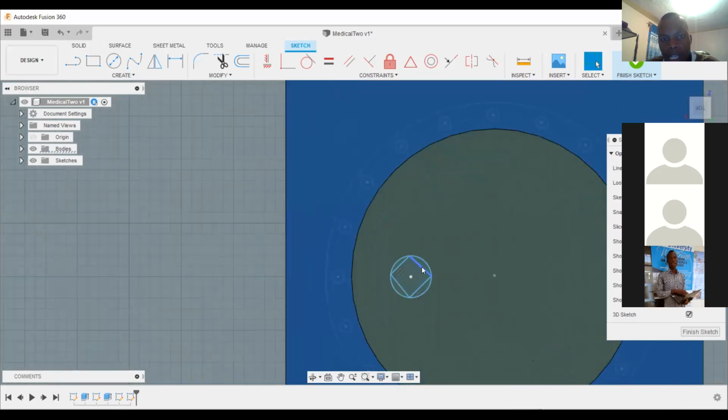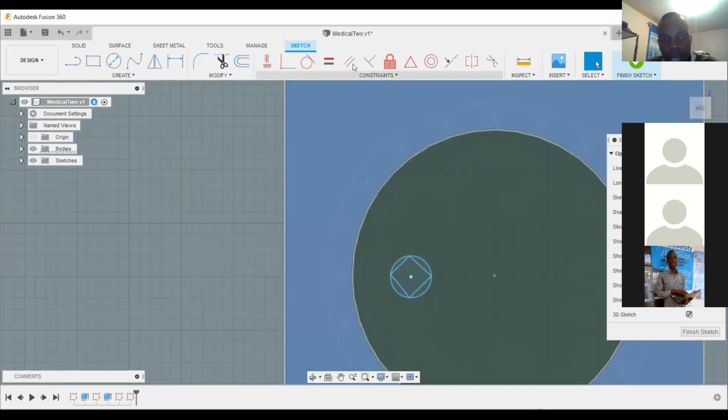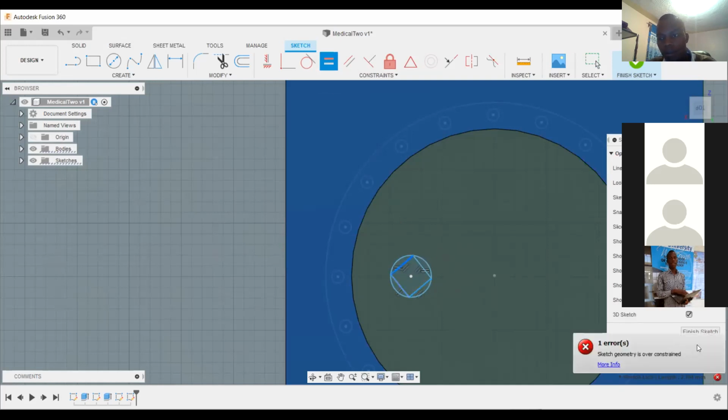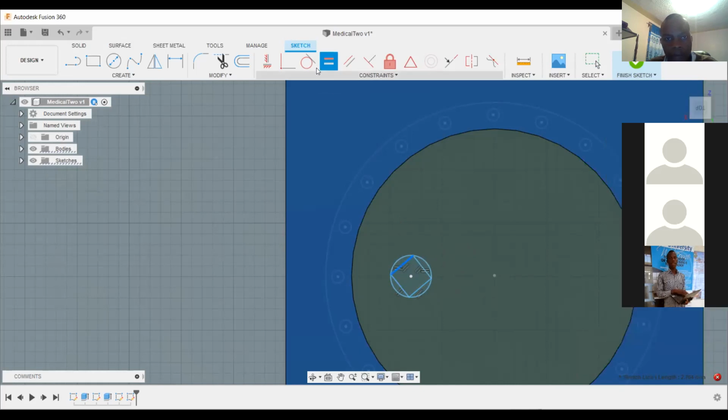Yes. And I want to show you something here. If you want sides to be equal, you can click this side, and then you can make them parallel. You click on this, and this to be parallel, and then if you want them to be equal, you click this, click this, click this, click this, so that they are equal and parallel. Do you see? So you go up there, there is an equal sign, and then there is parallel.